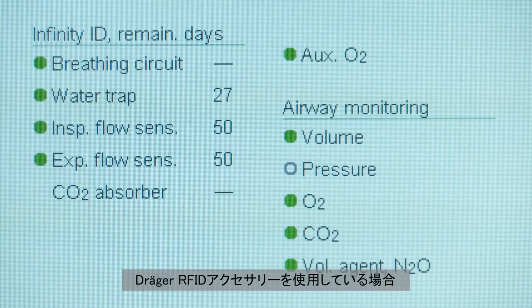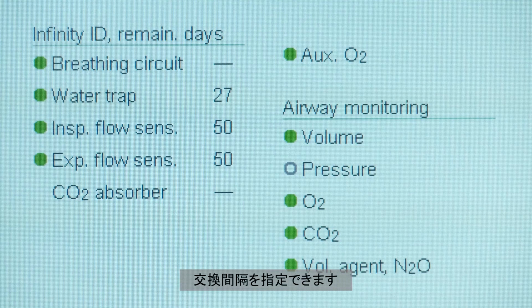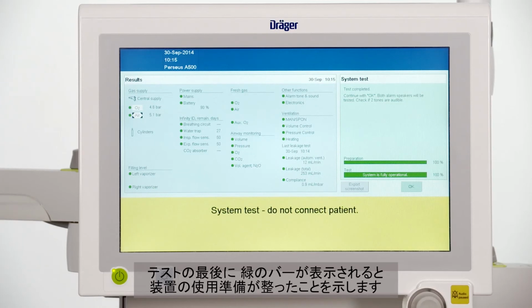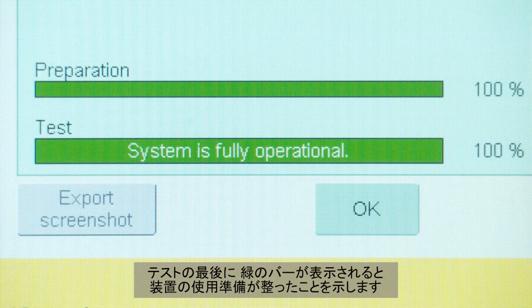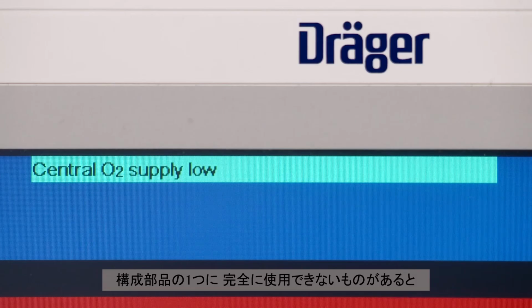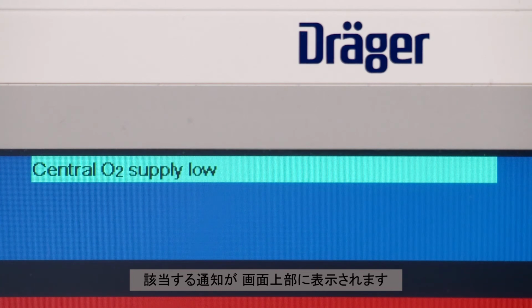If you are using the Dräger RFID accessories, you can specify the replacement intervals. In this case, you will see for how much longer you will be able to use the individual components. At the end of the test, a green bar indicates the device's full readiness for operation. Should one of the components not be fully operational, a corresponding notification will be displayed at the top of the screen.